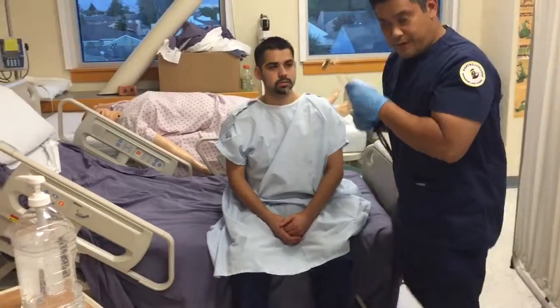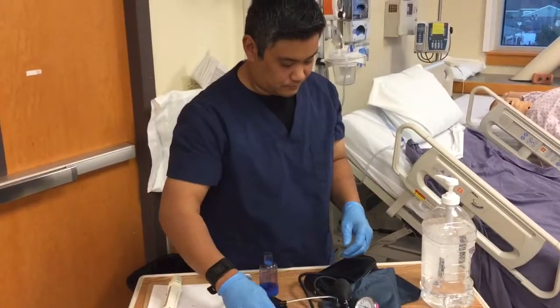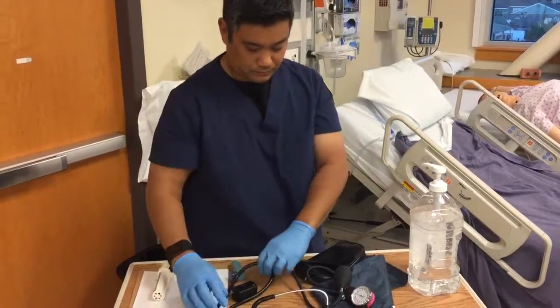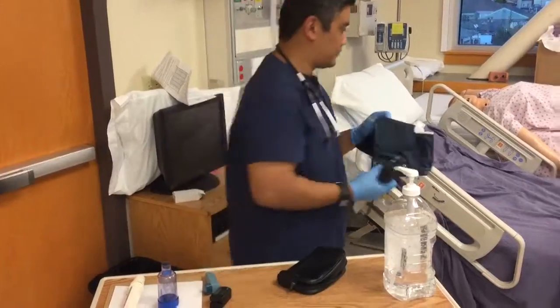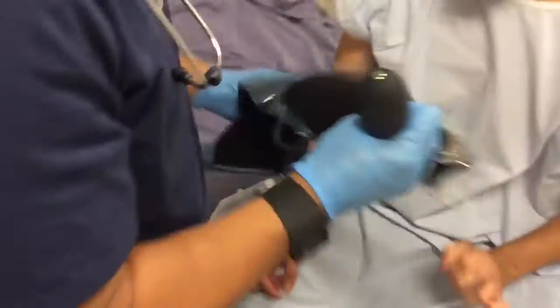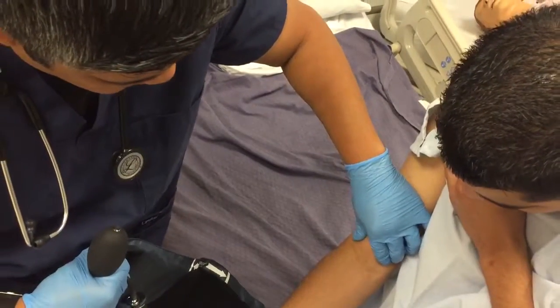All right, and finally we're going to be doing blood pressure once more. Let's go ahead and check that.